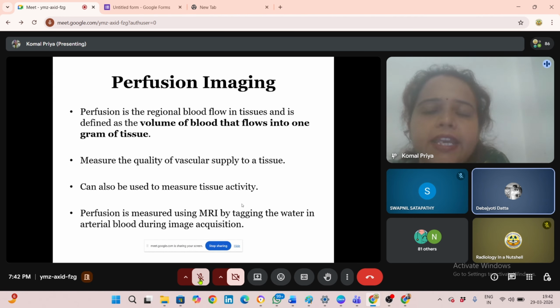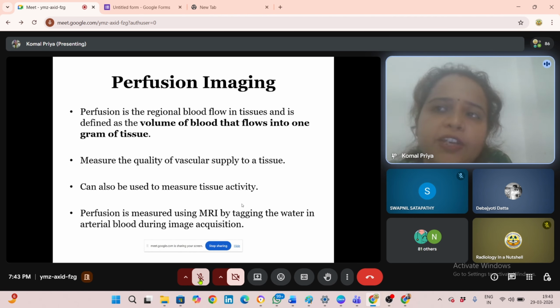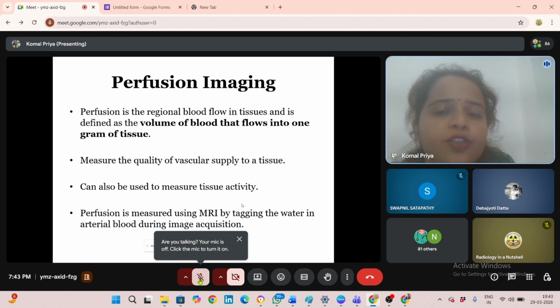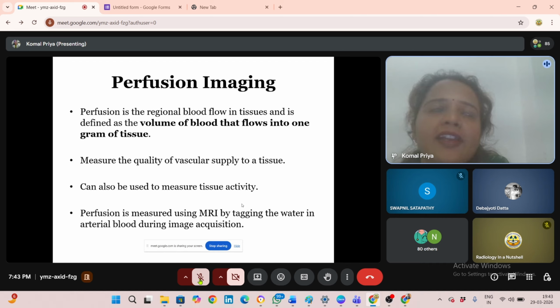Yes, what happens is when the patient goes inside, all those spins are aligned according to the energy, and when the RF pulse is applied, they start losing energy and joining the high energy population, and that's how the net magnetization vector decreases, and then they start to wobble with a particular frequency which is given by the Larmor equation. All those things are there. I just wanted to know that you all have a brief idea or not. Okay, very good. You all are aware of this.